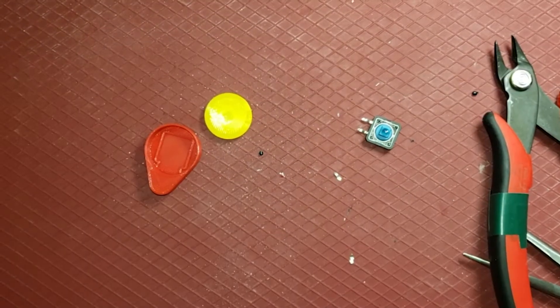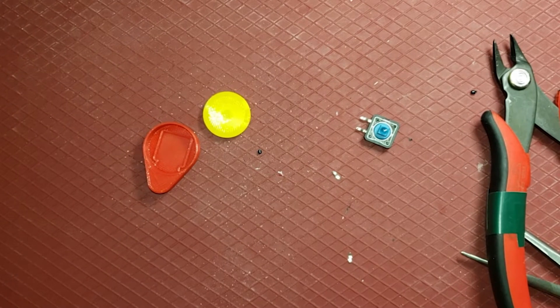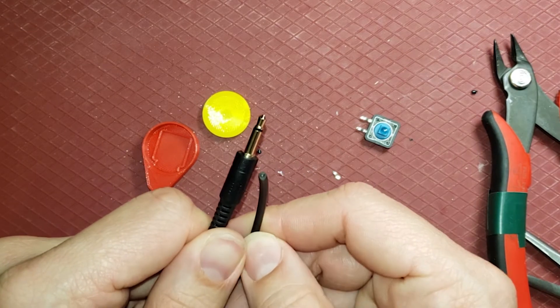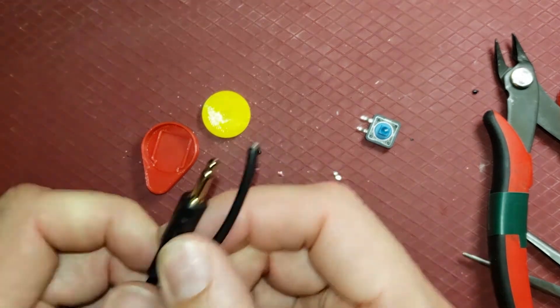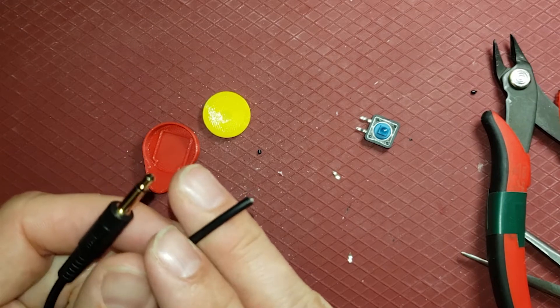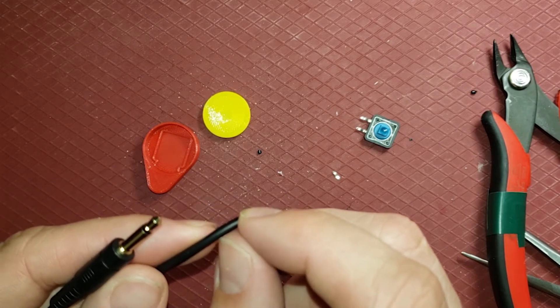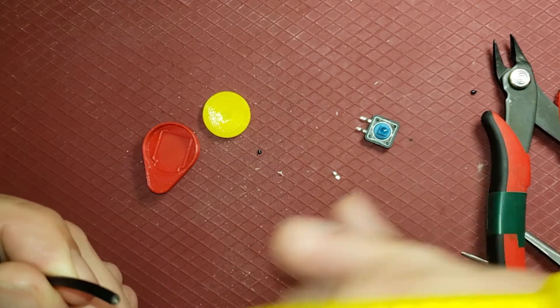With my mono cable here, you can get a longer mono cable cut in half and you get enough for two switches. I'm going to use my wire strippers here, strip off a couple of centimeters, and then from there I'll strip off a bit of the insulating wire on the inside.